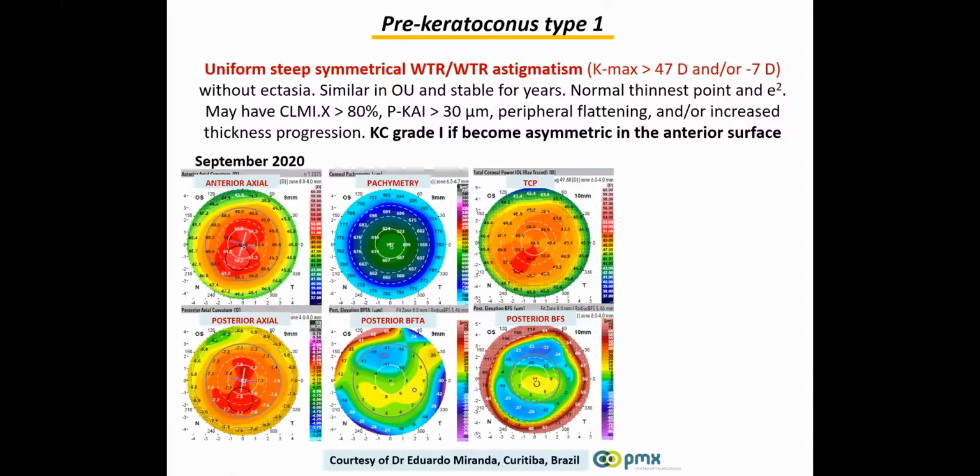This is another case coming from my friend Eduardo Miranda in Curitiba. Observe, everybody would interpret this cornea as keratoconus.